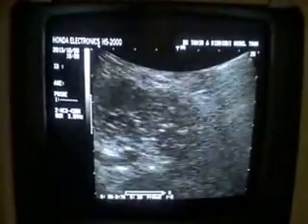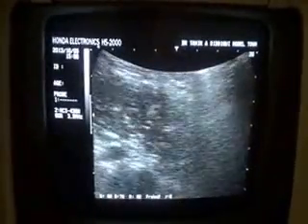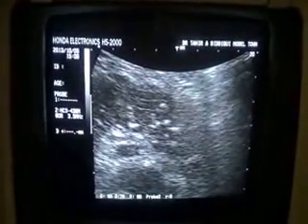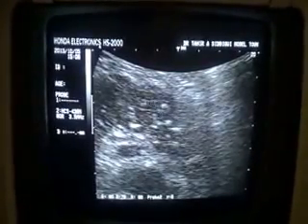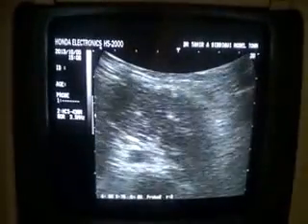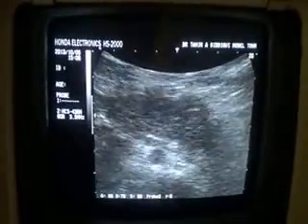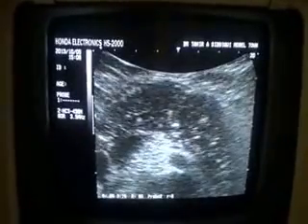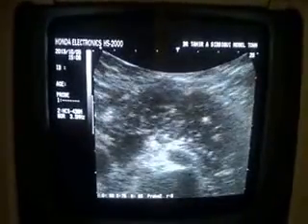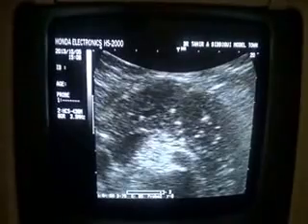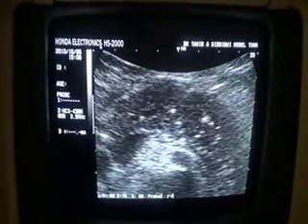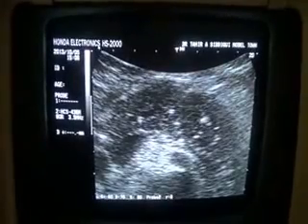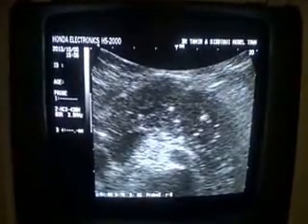This is the tail of the pancreas — these echogenic tiny particles. These are all calculi. As in the center of the image is the body of the pancreas. See these areas — all these tiny echogenic particles, hardly giving any comet-tail artifacts.